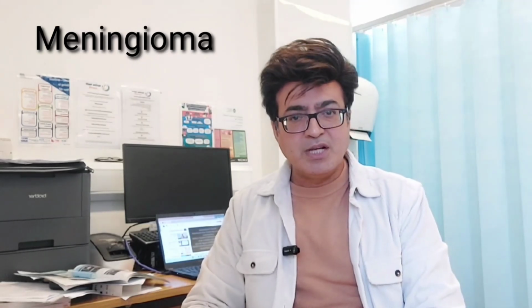Today I'm going to discuss meningioma. Meningioma arises or originates from the arachnoid cell rest, and WHO has classified it into three categories. According to the WHO classification, grade 1 is a typical meningioma with benign characteristics, and 90% happen to be typical, while WHO grade 2 shows atypical features with increased mitotic activity and necrosis. Grade 3 is anaplastic and highly malignant.